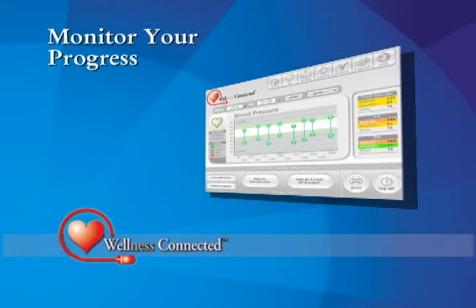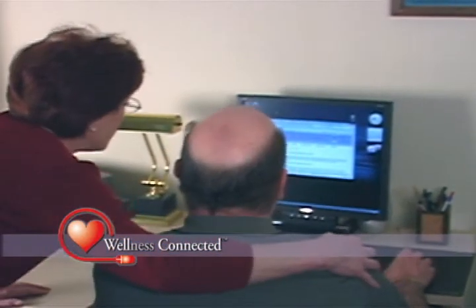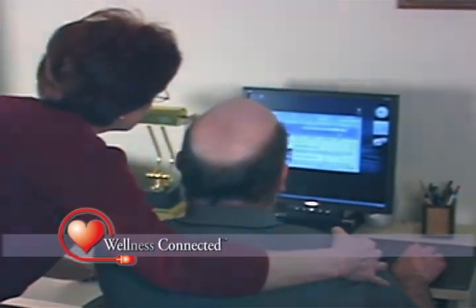The Wellness Connected software makes it easy to see your progress over time with easy-to-read charts, graphs, and details. You are now able to easily and accurately measure and track your blood pressure, and knowing if you have high blood pressure is the first step in getting it under control.